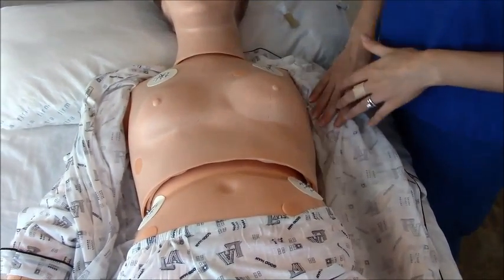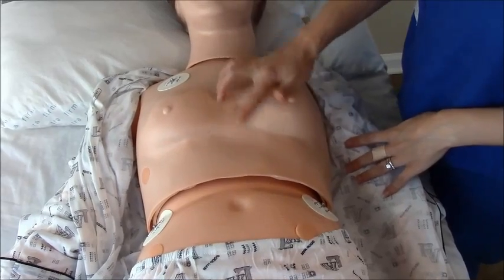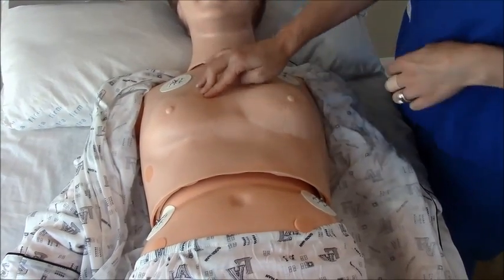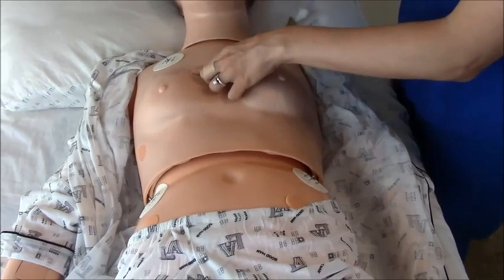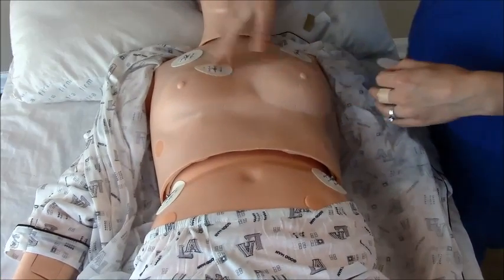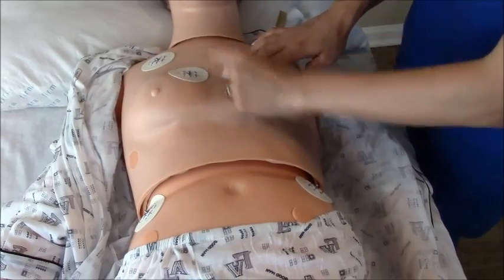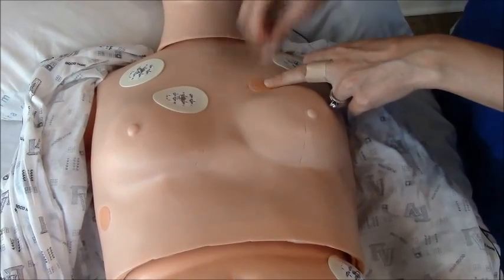Now we have our limb leads on and we're going to do V1 through V6. For V1, find the right of the sternum and go to the fourth intercostal space of the ribs — that is where you place it. Prep with exfoliation paper and alcohol, then put your lead on. V2 goes on the left side of the sternum at the fourth intercostal space, so it should be horizontally matching up with V1, just on the other side of the sternum. Prep, clean, and place your lead.